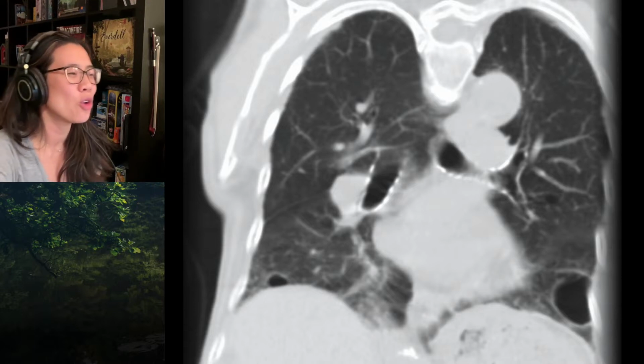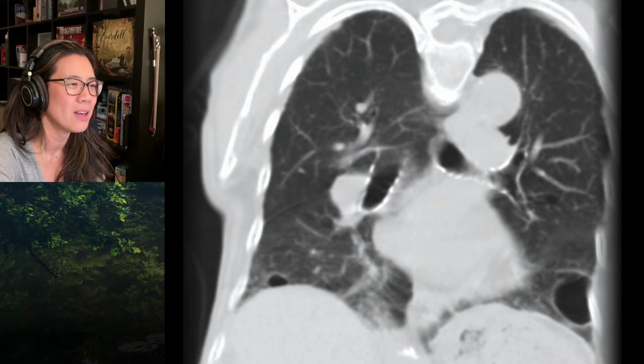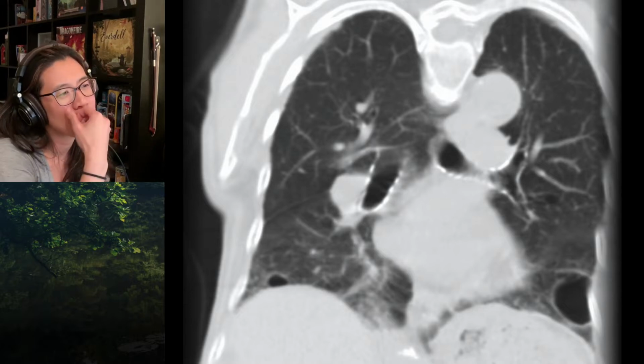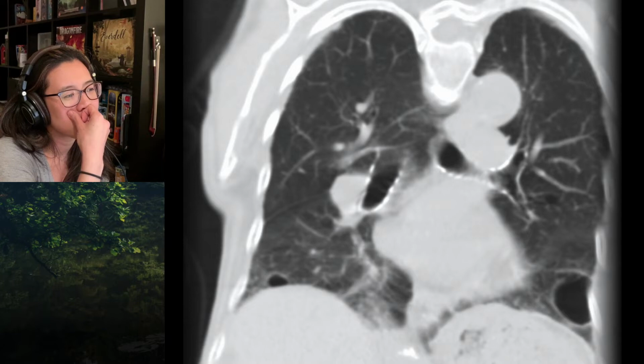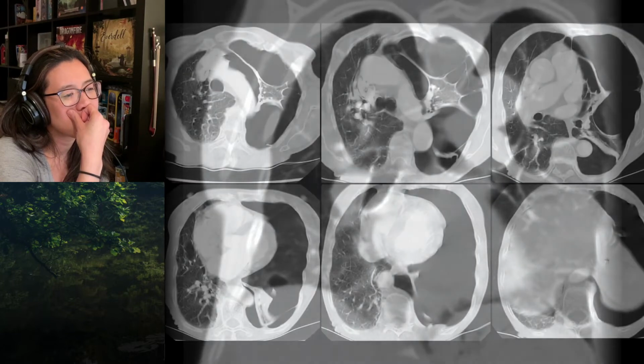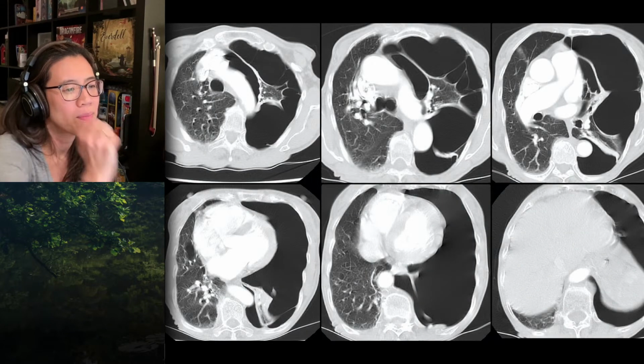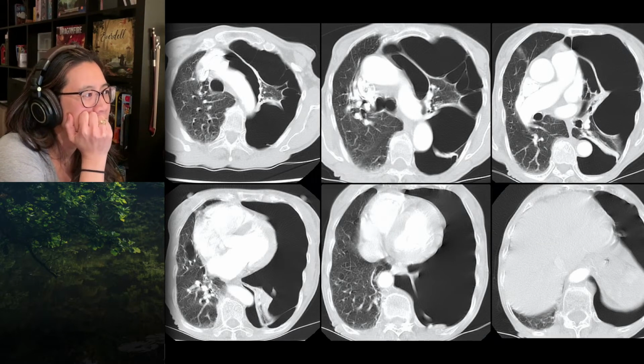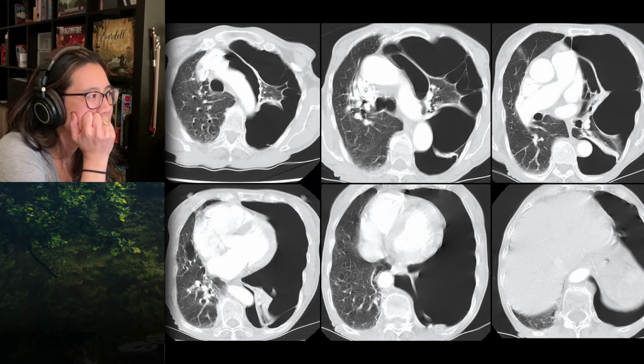How certain are you, Bob, that it's definitely not bullous disease, now that you've seen that it's resolved? I've scanned through the CT. It's fairly clear on the CT scan. I'll go back to the previous slide. If you look at the top image, she's got what looks like normal compressed lung on that top left image. Yep. And the top two images, she's got normal lung, and they're just pleural adhesions.